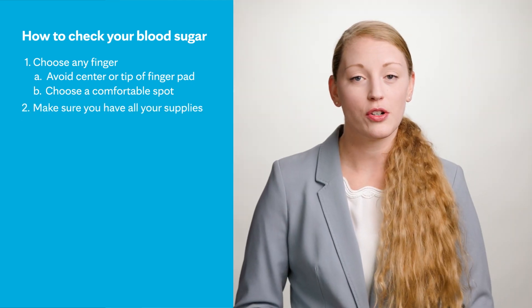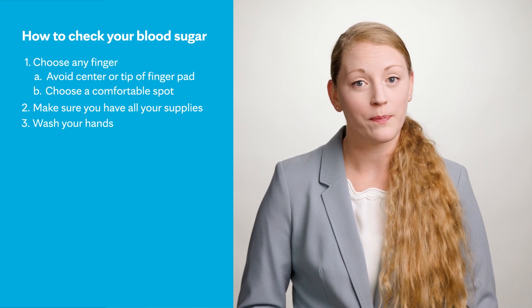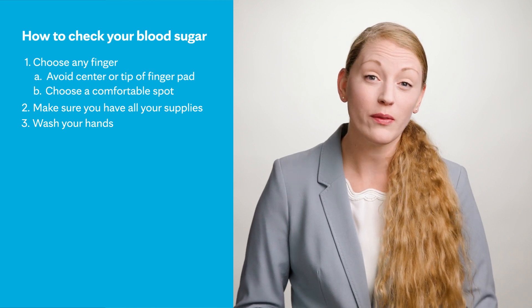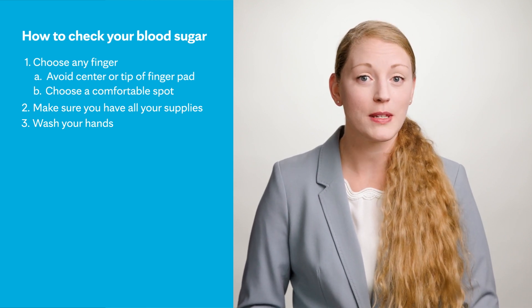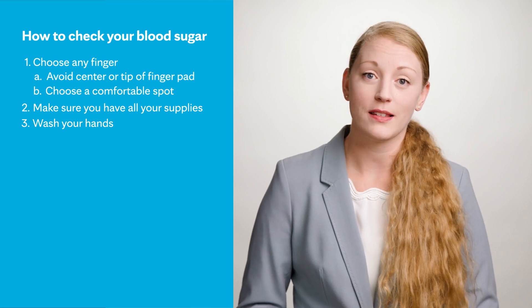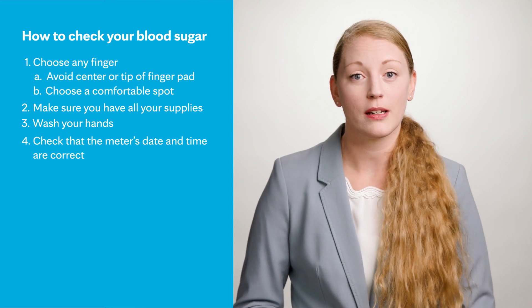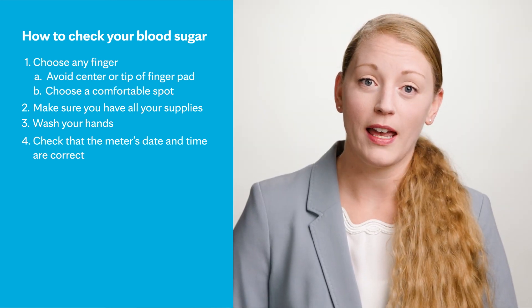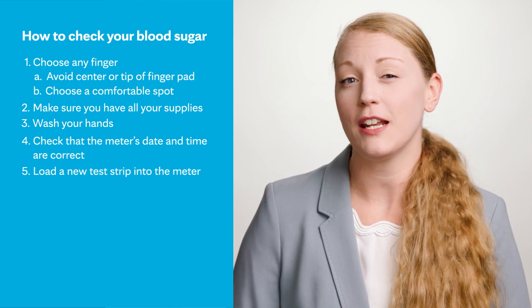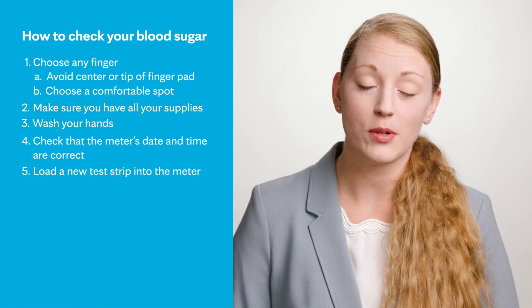First, make sure you have all the supplies needed. Wash your hands with soap and water — this removes any residues from hand sanitizers, lotions, or food from your fingertips. Once your hands are dry, get your testing supplies ready. Make sure your meter's date and time are set correctly, then take a test strip out of the container and close the container right away, as the strips are susceptible to moisture.